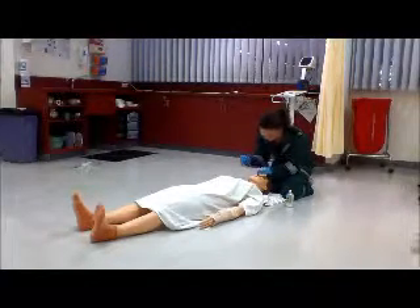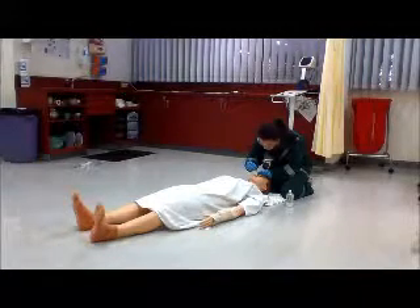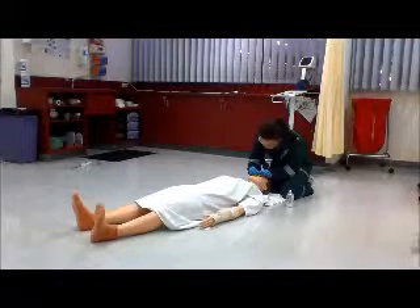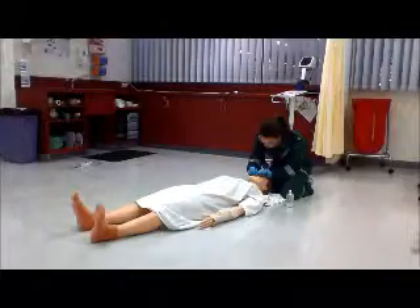Pick the largest nostril, pulling the top of the nose towards you, and gently wiggle the NPA in. If you come across any obstructions, don't try to push it too hard because you might cause damage to the patient.